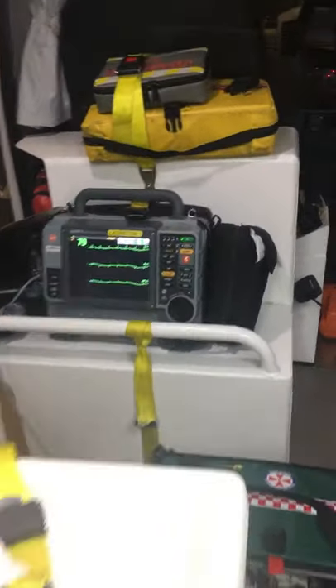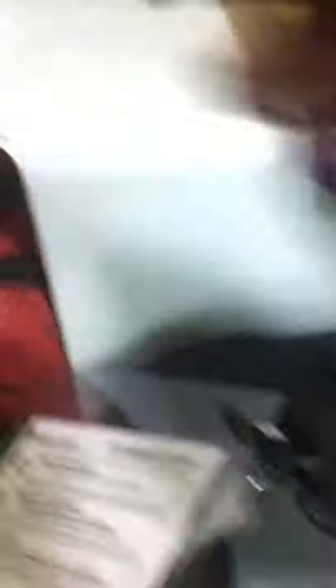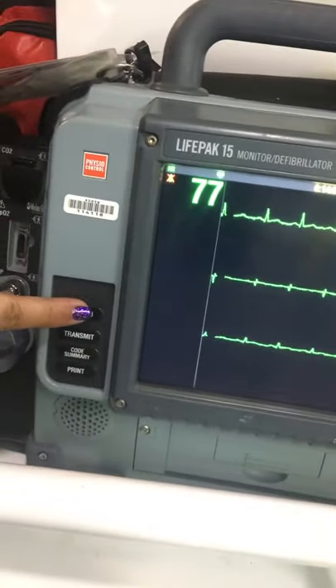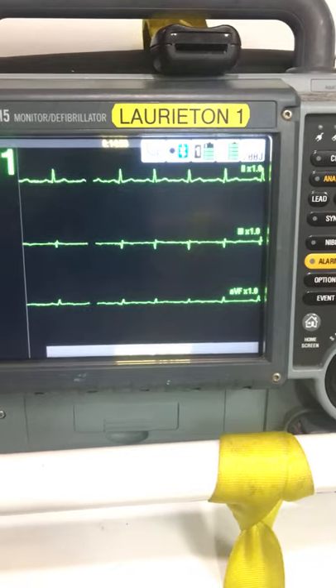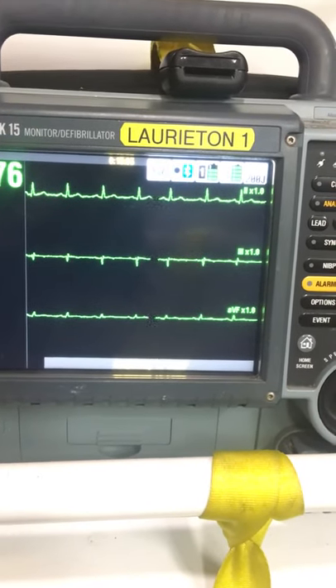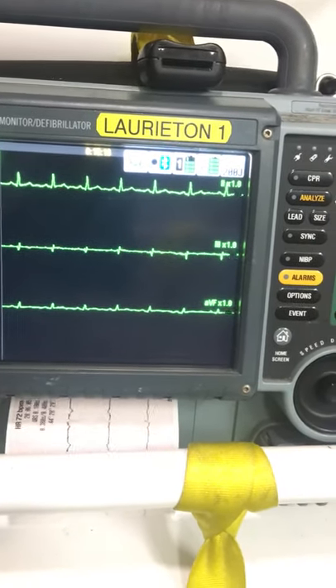Now wander around to the machine. On the left-hand side of the machine there's a button that says 12 Lead — press that when you're ready. It's acquiring. I didn't say anything because if someone talks or moves it readily breaks the recording.